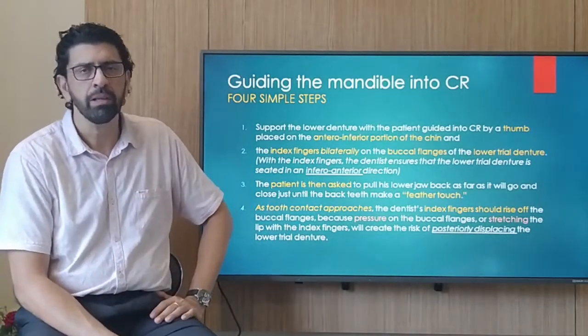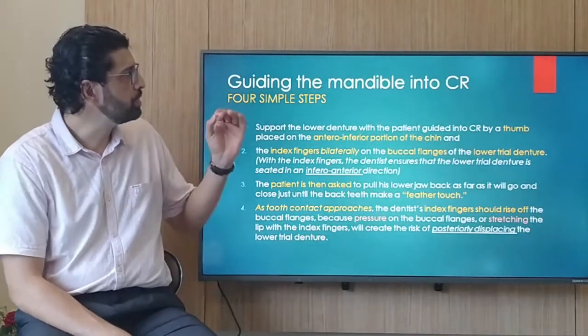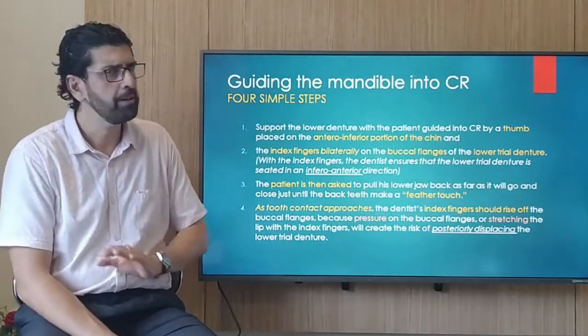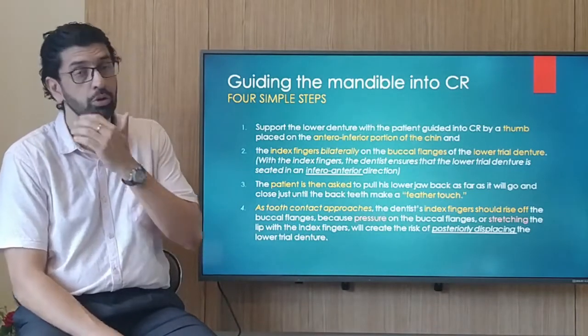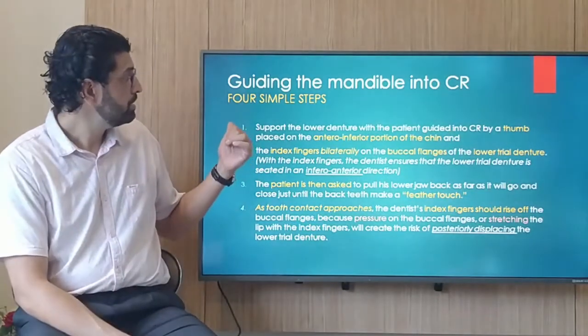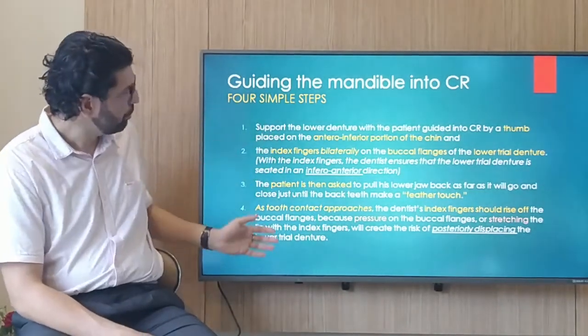Now, before we get into this, let me tell you how to guide the mandible into centric relation. Very important. You need to get this straight, because if you don't get this straight, it's going to be difficult all over. Okay. So how do you guide this? I put 4 simple steps. Okay, got 1, 2, 3, 4 there.